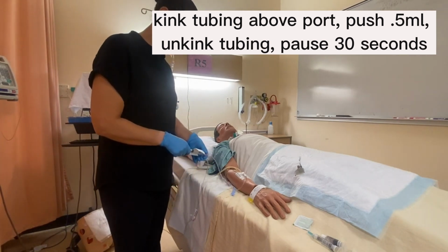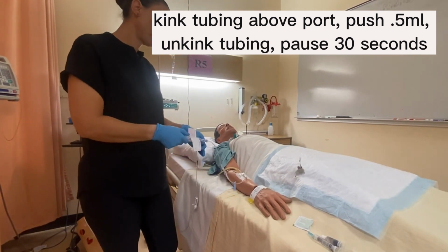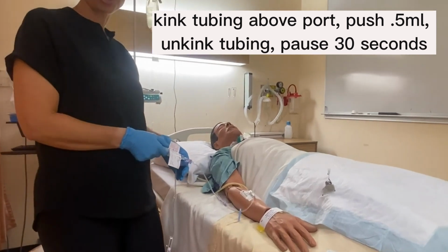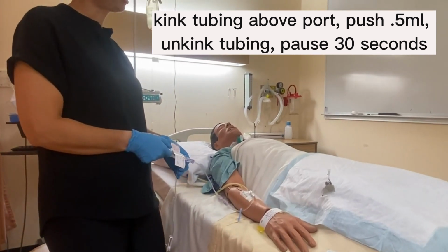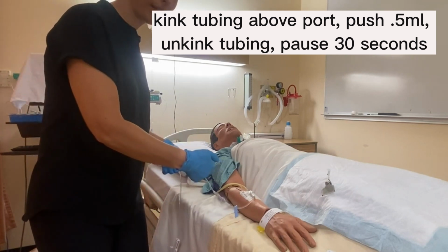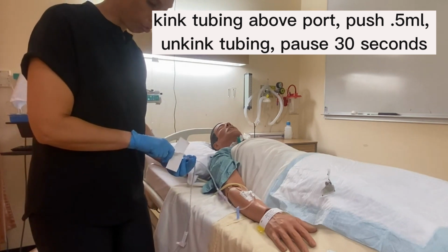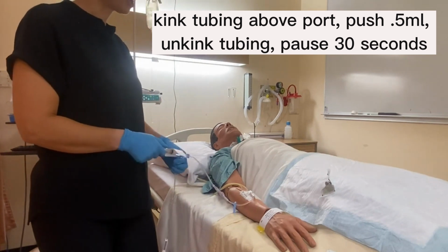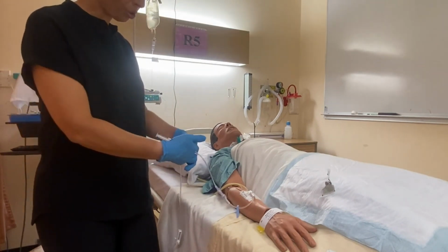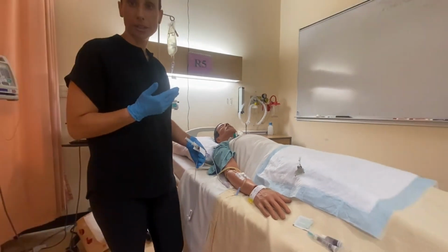All right, and so then I'm going to kink after 30 seconds, push another 0.5, and unkink. Observe for any reactions. Watch the clock for 30 seconds. So we're doing a push-pause technique. We're going to push a little bit of medication, pause, push and pause. So we would keep going 0.5 every 30 seconds, so that eventually the whole syringe and medication will go in, and that should be approximately 5 minutes.